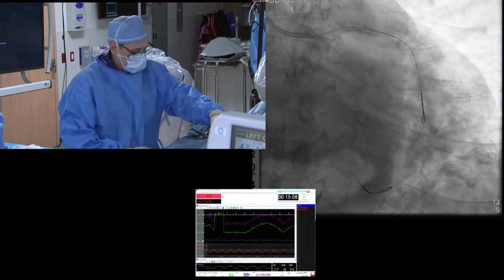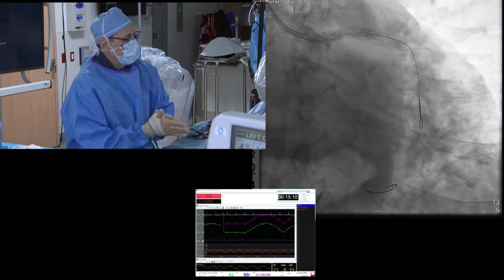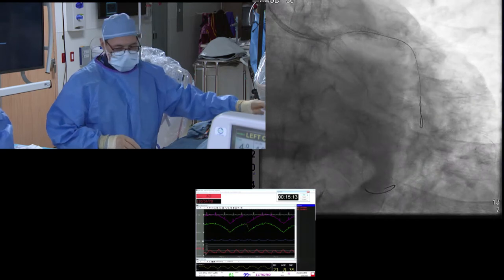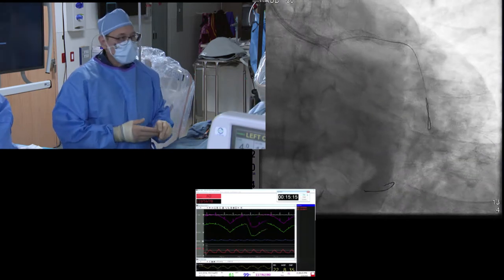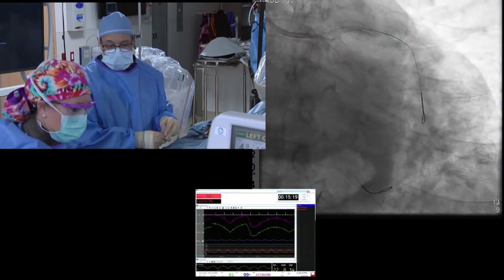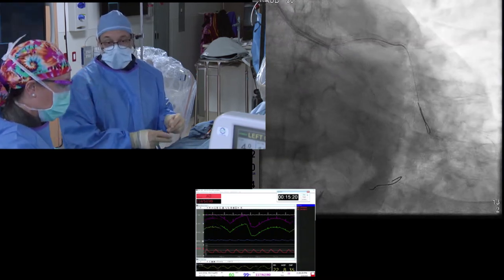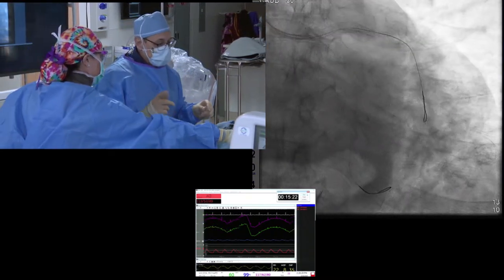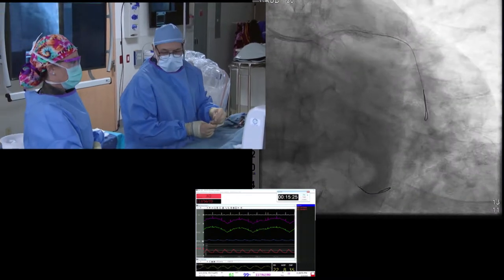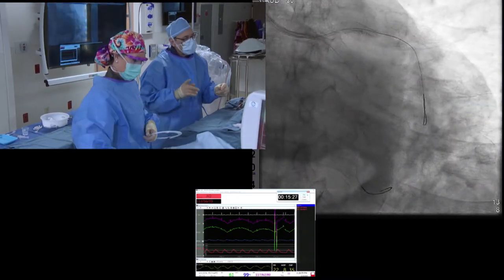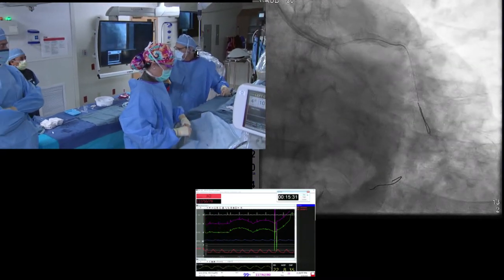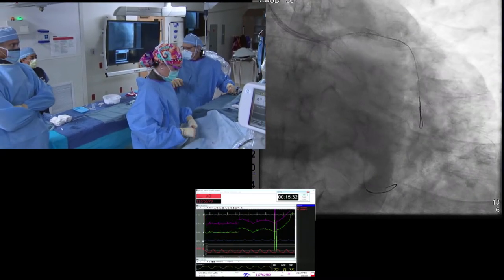Whenever you're working near the left main or distal left main, it's always good to have two wires in, in case you have plaque shift — you don't have to worry about traversing with a new wire. Especially given how difficult it was to wire in the first place. Bimal is here as our OCT guru. I don't think my OCT is going to go through that tight lesion, so we'll use a 2.0 NC balloon.